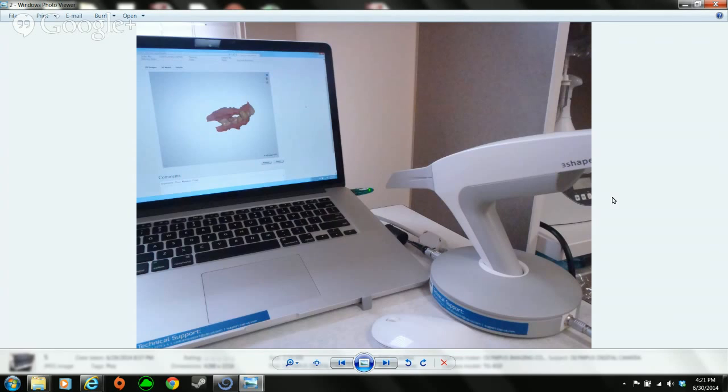They work phenomenal. The key to all-on-4 is that the scan appliance must fit the mouth very stable. Whatever you're going to use for a scan appliance, if it's their denture or if you're going to do a new setup, it has to fit perfectly in the mouth, because however it fits in the mouth is how the surgical guide's going to fit. And if you get a good fit in your scan appliance, it's the exact same protocol. You can use the one drill technique, or you can use a tube within a tube, and it works very nice.